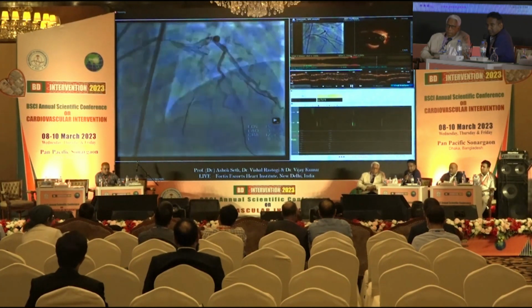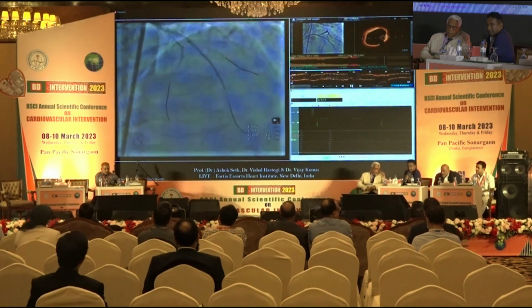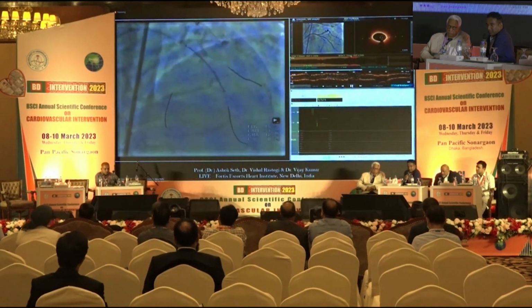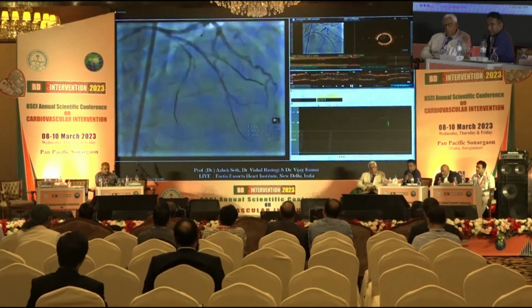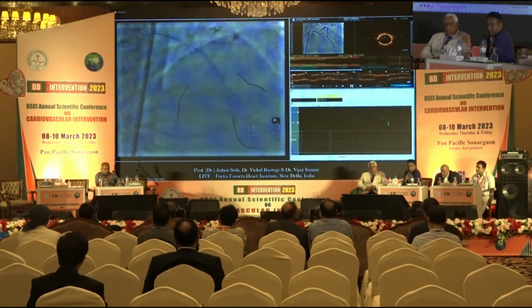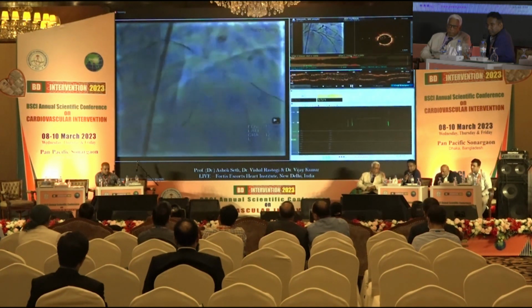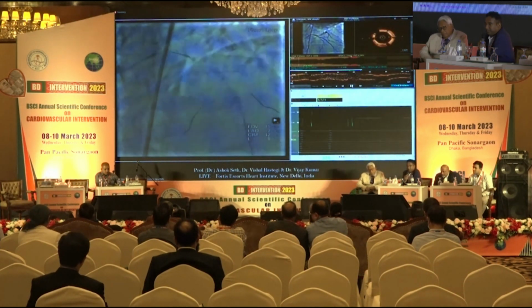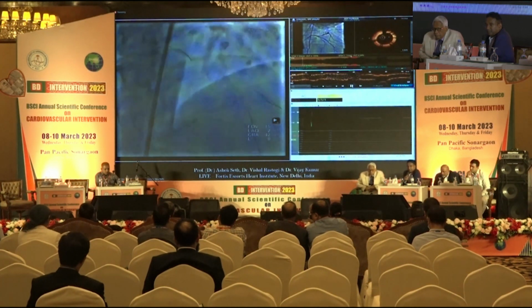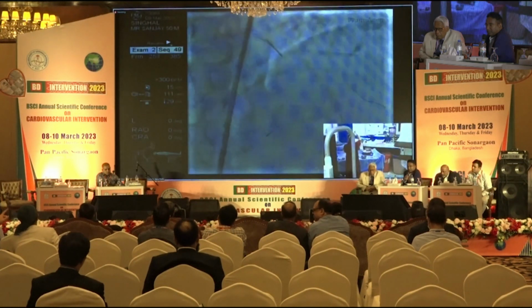So here's the stent, which is an Onyx, into the distal vessel and implanted, and then taken up to 18 atmospheres and then post-dilated. And by this time, the diagonal 2 had also closed up, obviously with high pressure dilatations, and he was now getting more chest pain. So we now have a recrossing of the diagonal.